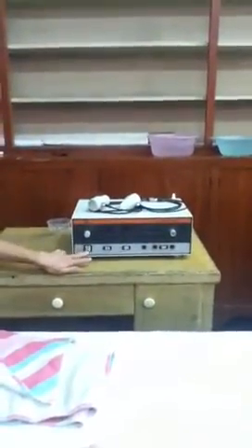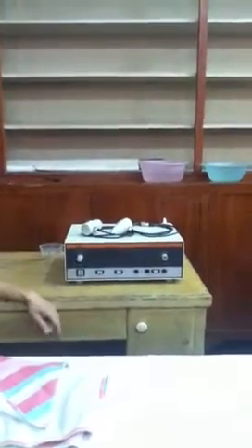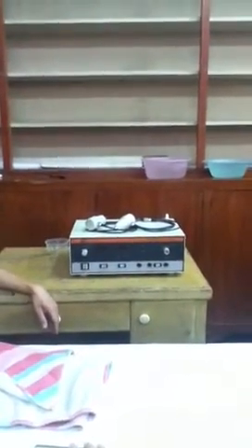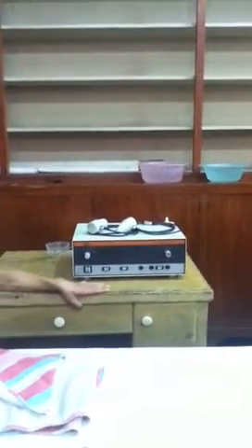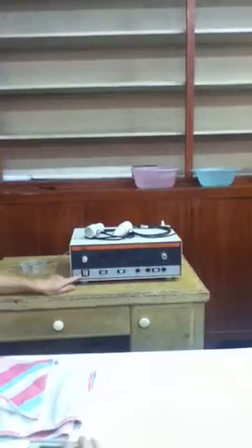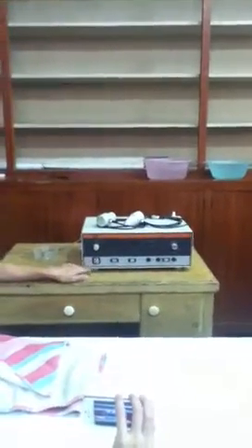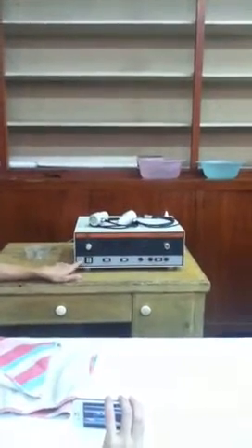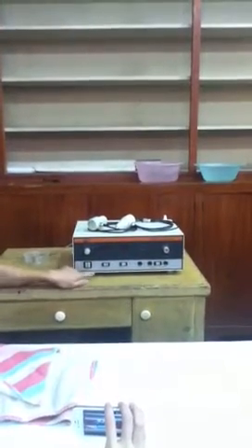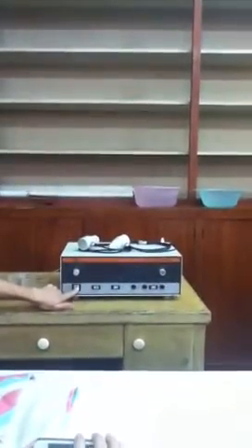We are using the standard one. Usually I start with this one. If it's off, they have a symbol there with 0. If on, it's a vertical line. So you just have to switch that on.